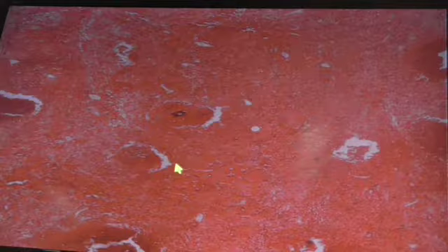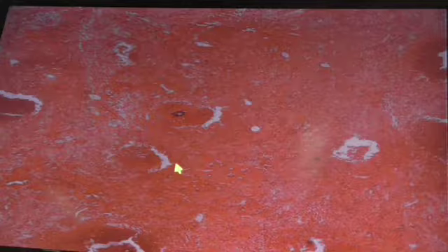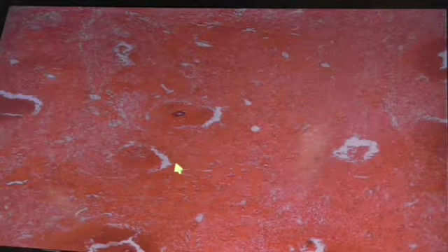So what do you find in that skin there? What was the overall appearance? Can you name a couple of things you saw in that skin? Miss Montero, what lesions did you see? Abnormalities? Well, we see the skin is thin. We have maybe some areas with dilatation and lacerations.